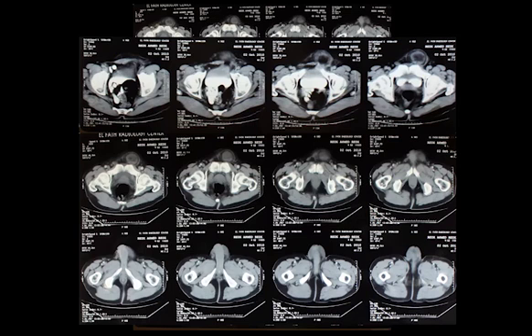I don't have a clear answer, Pradeep. I don't know. In this country you can get images the way you want. There aren't very strict rules on why you get or don't get an image, particularly in a non-academic area. But I don't know why they got this CT done. I may have known and forgotten. At least it's a good chance to review hernias and sliding hernias and this sort of thing. If I get back to my notes, I may remember why we got it.